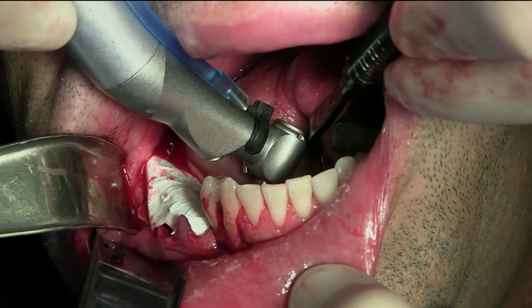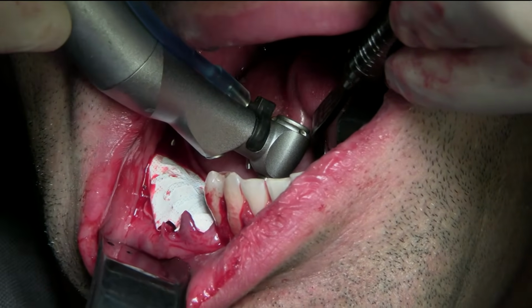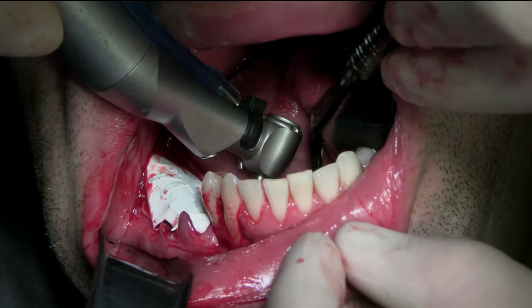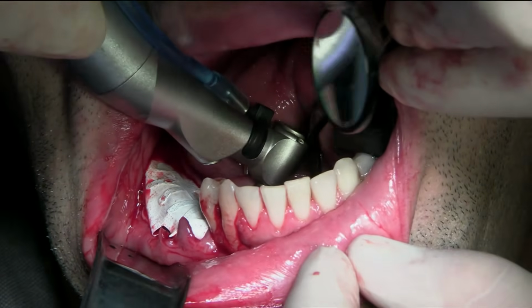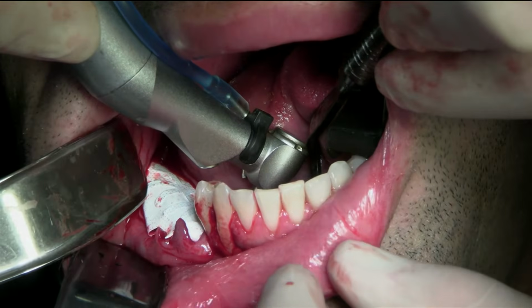I need a mirror because I cannot see anything. So maybe a small mirror. I want to see where the screw is.